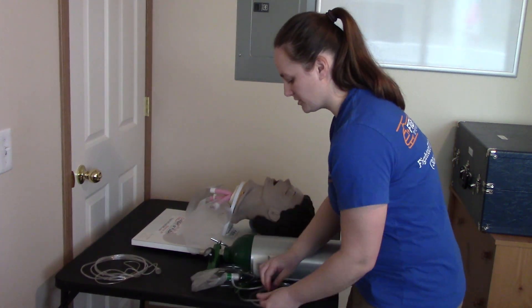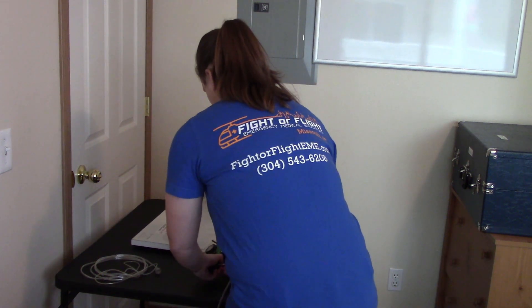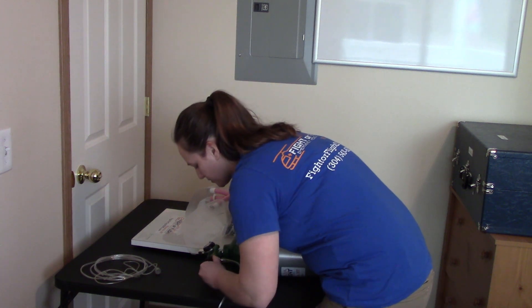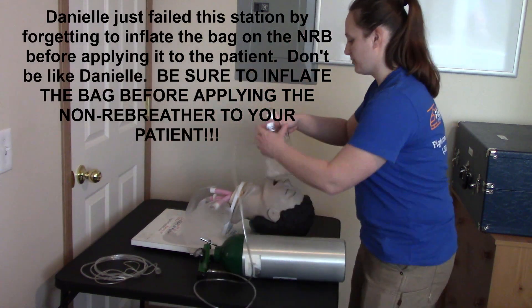I will now attach the non-rebreather. As the examiner will tell you to do, apply the non-rebreather to the patient. I will adjust the oxygen to 15 liters per minute and apply the non-rebreather to the patient.